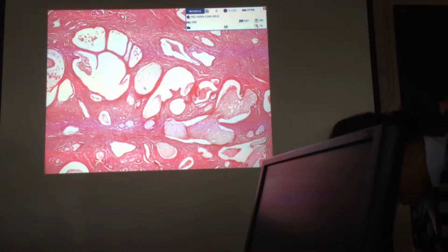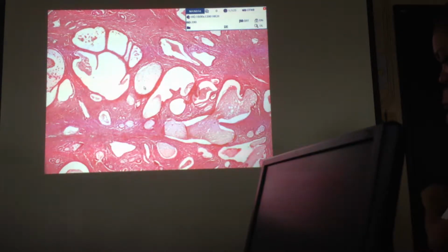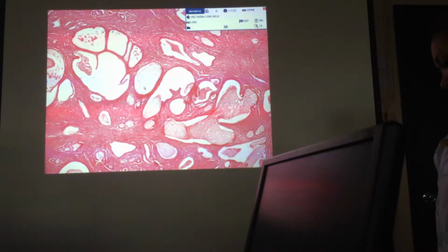kakaroon ka ng mitosis, and then you have the subnuclear vacuolations, stromal edema, okay? Although mahirap siyang intindihin, okay, but you get to know the particular dates of the endometrium, especially if you're thinking of having an ovulatory cycle, okay, and the OB would like to date which particular period the patient is undergoing. So kung secretory ba or proliferative, and that's where the treatment will come. Okay?